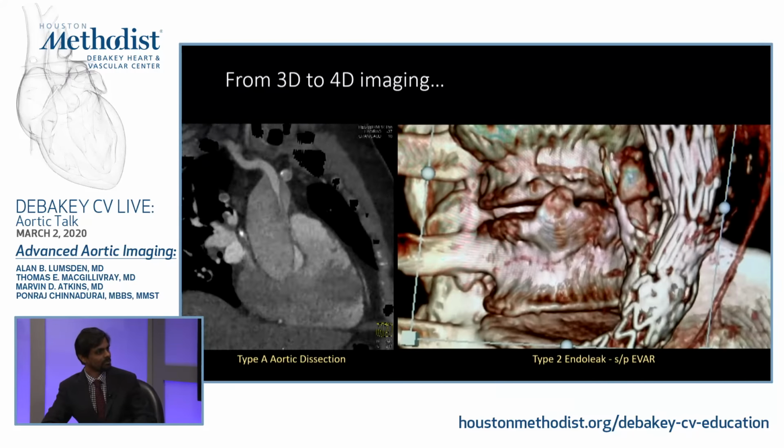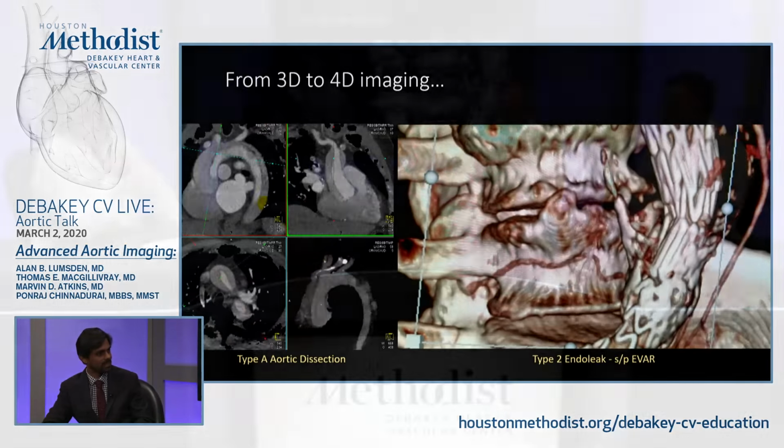You're saying we can figure all this out beforehand? Yes, absolutely. We have done maybe close to 25 patients now with these dynamic CTs, and we're also doing a little bit more MR as well to map out these endoleaks for infrarenal aneurysms. And I'm hoping we don't see this as many with the newer stent grafts, and even moving into the thoracic space or even branched endografts, where it should be very critical to differentiate between a type 1 versus type 2 in the presence of all these complex constructs that we are putting in these patients.